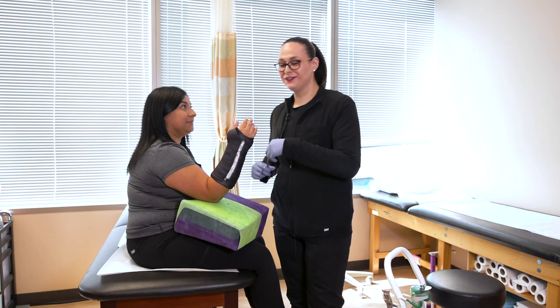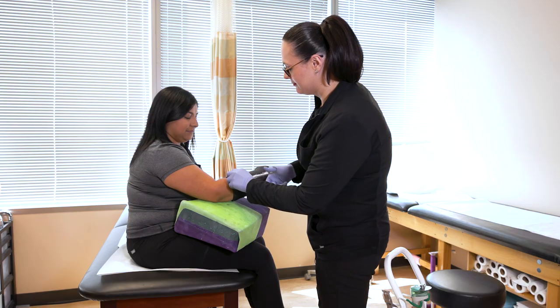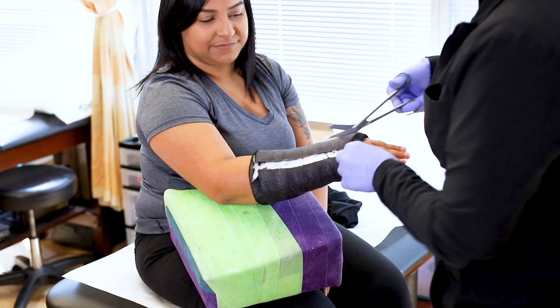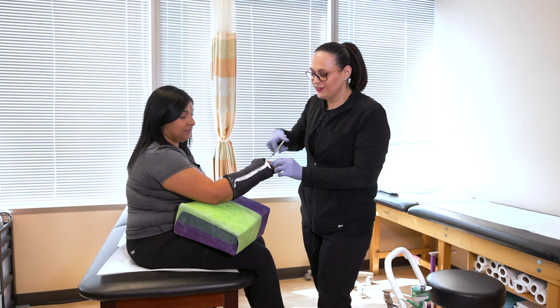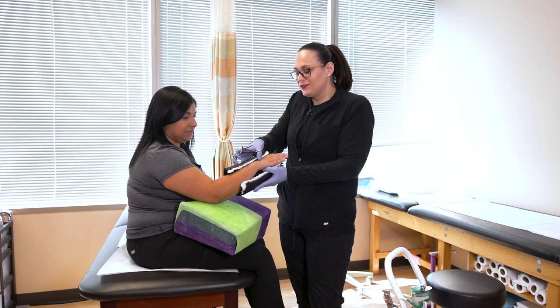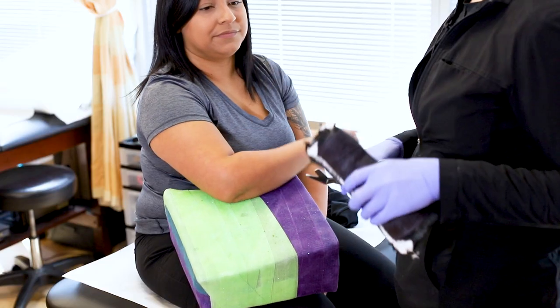Now we're ready to cut it off. All of this undercast padding that we put in prior to the fiberglass acts as a protection barrier between the cast saw and your skin. That's another reason you want to make sure you don't pick the cotton out — some patients do tend to do that over time — so remember, we need that cotton in place to protect your skin from the cast saw.